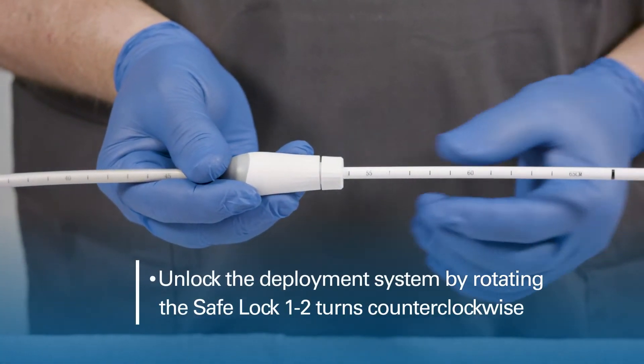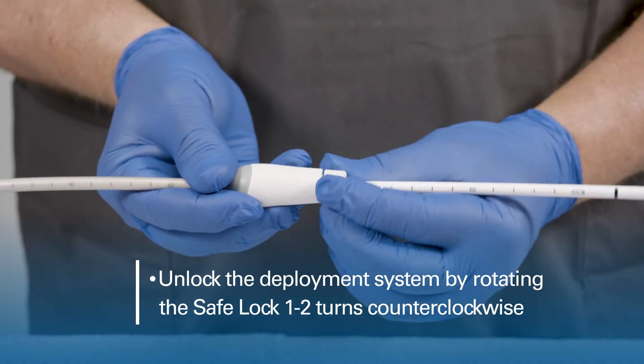Unlock the deployment system by rotating the safe lock one to two turns counterclockwise.